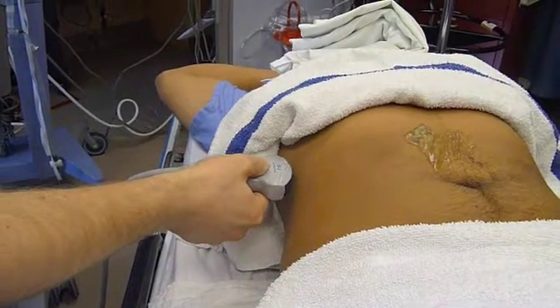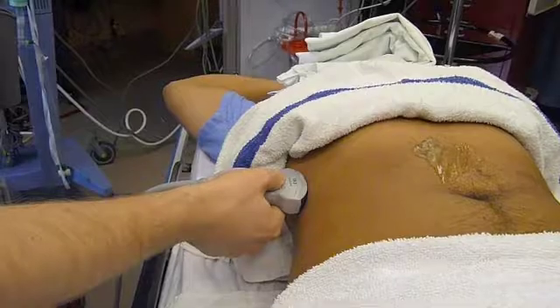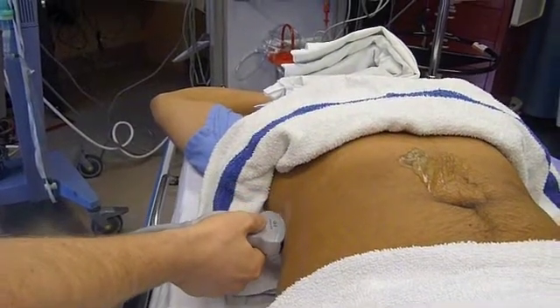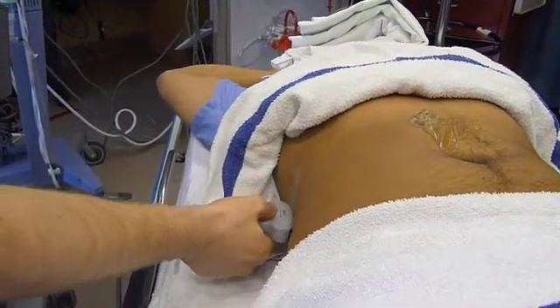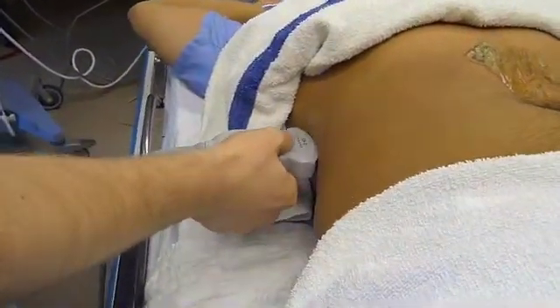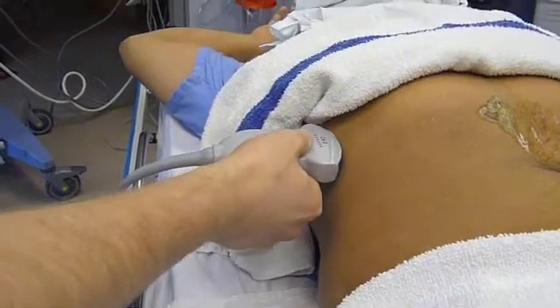Let's start with the right upper quadrant. That's where you're most likely to find free fluid. Hold the probe at the level of the xiphoid and move it anteriorly and posteriorly until you visualize the kidney.